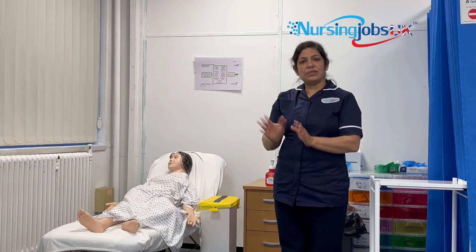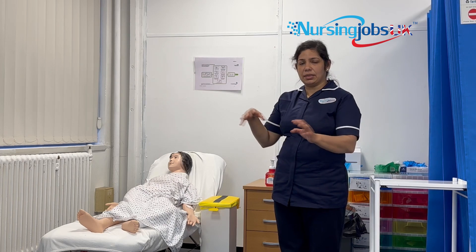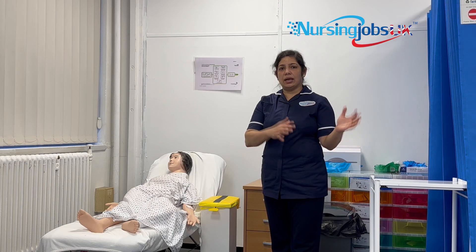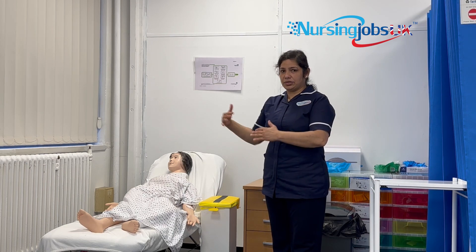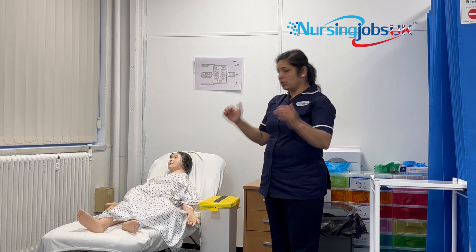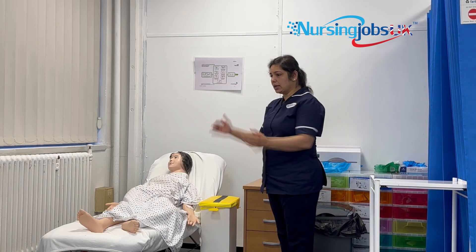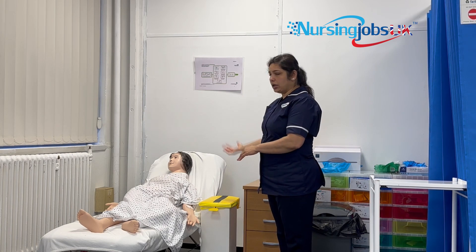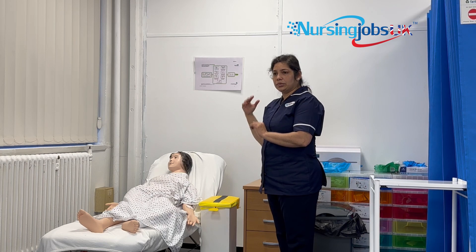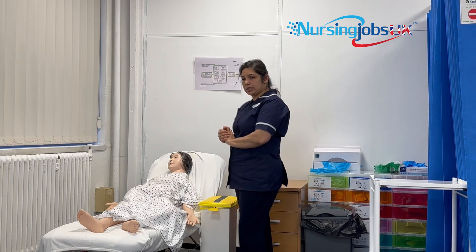I am focusing on wound assessment and ANTT, so I'm not covering the initial parts. If you have any doubts, please watch my other videos for the safety check and the rest. We consider the safety check, hand check, introduction, allergy check, and pain check already completed, so now we're starting with explaining the procedure.